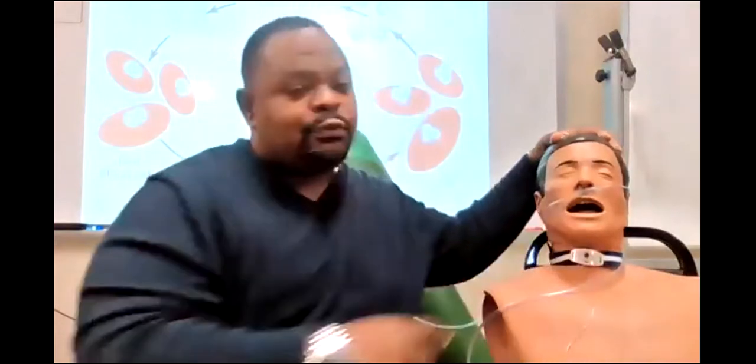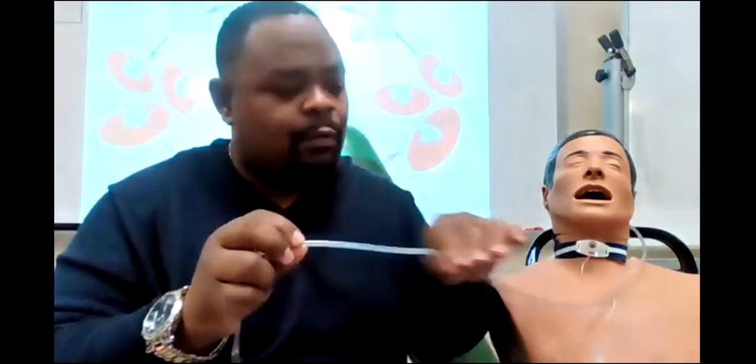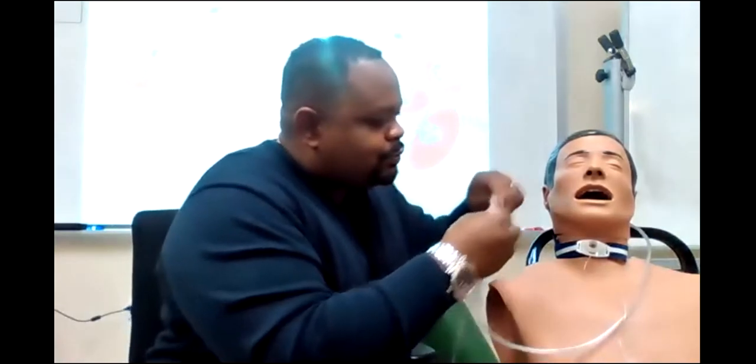You can't see this man's uvula. But for this case, it wouldn't be a binasal prong. It would be one catheter, right? It'd be like one little tube, like this, with some holes at the end, right? And I would put some KY gel, that's what we use in the hospital, some KY lubricant on the actual tube, and take that tube and insert it into his nose, okay? I will push it into his nose until I see it drop down just below his uvula.